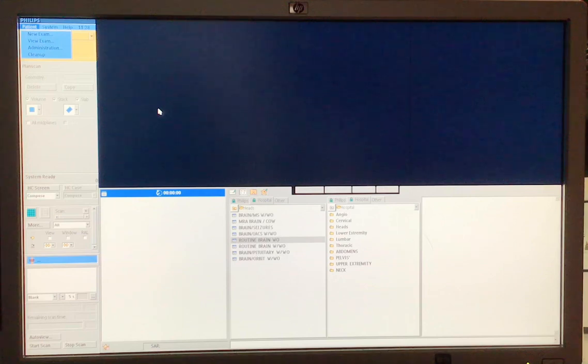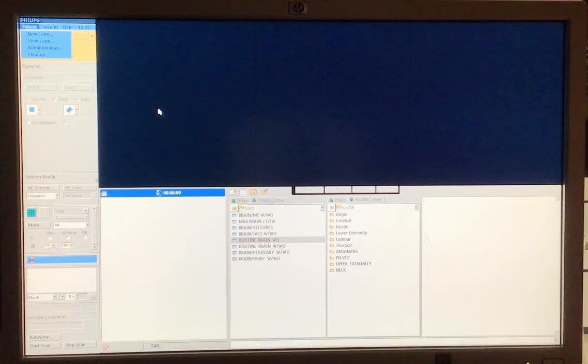I'm going to go ahead and just jump into how do we scan for an MRI routine brain. What you all will want, and I'm showing you here this paper of the practical requirements. This is what you are going to want to bring when you come in for your open labs, because you can take notes on this. We're going to go through each of these numbers, number 1, number 2, number 3, because technically these are all 4 different types of pulse sequences. And you can write notes as we go over this here in the lab lecture.